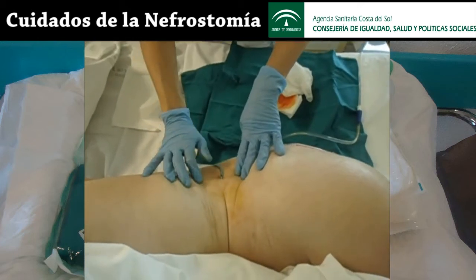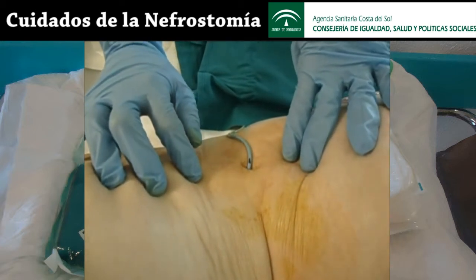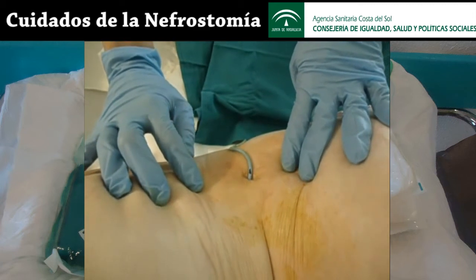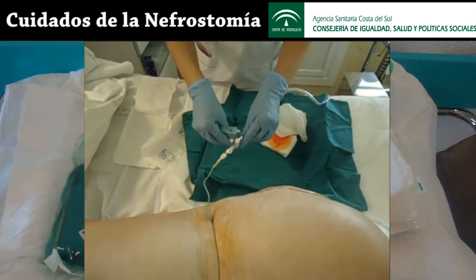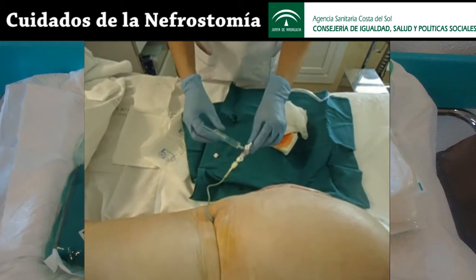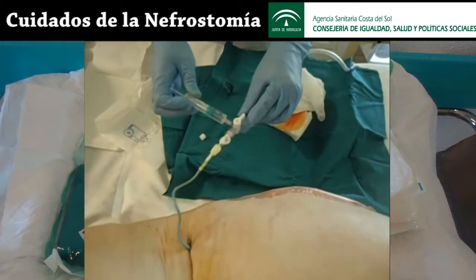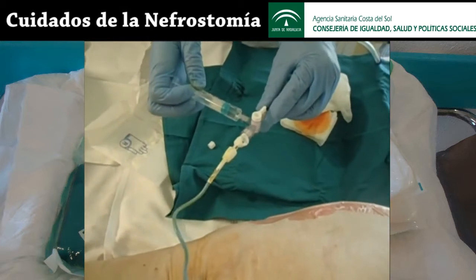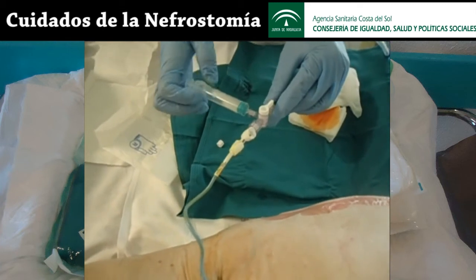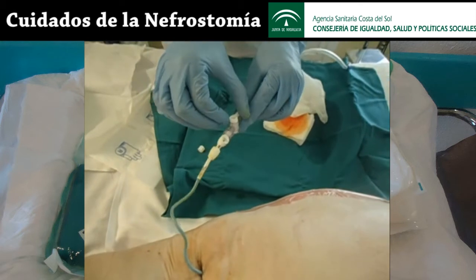Please check that the tube is not longer than when it was put in. It is essential in order to verify that the catheter was not moved or come out of the kidney. Another important step to be taken when performing the care procedure is to verify that the nephrostomy catheter is permeable. Use a syringe with saline solution, gently force the solution into the tube and verify that the tube is not blocked.